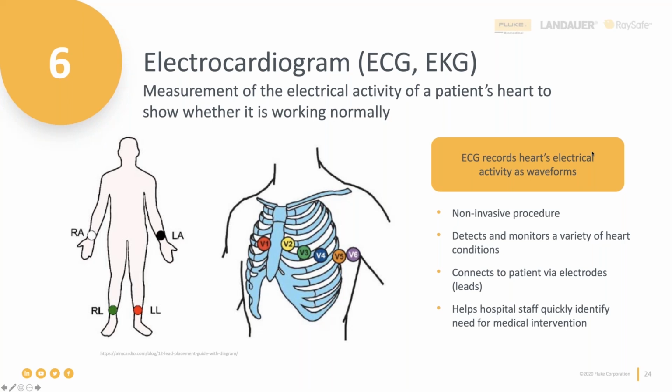Generally speaking, there are 3 methods of placing leads on a patient. There's a 3-lead, 5-lead, and 12-lead placement, with a 12-lead placement being the standard, simply because it provides the most information about the currents in a patient's heart. It is good to know that the OEMs are looking into making 15 and 18 lead placement ECG monitors, which will be even more informative. But as of right now, let's take a look at the 12 lead placement.